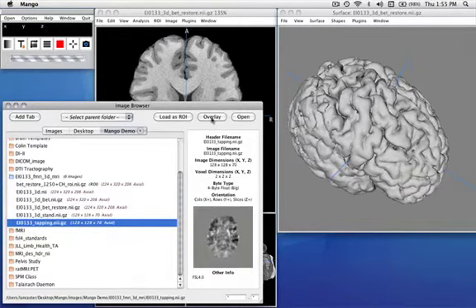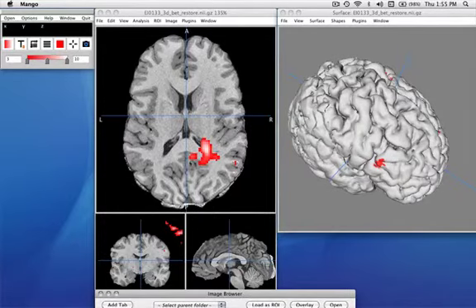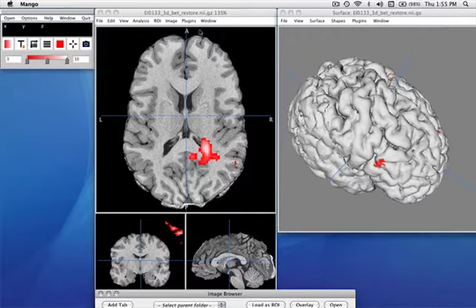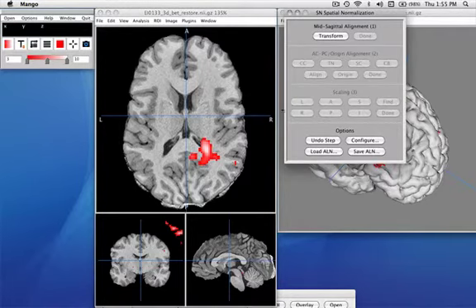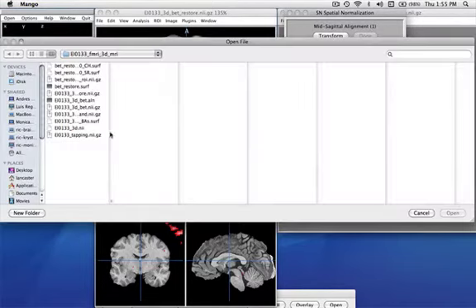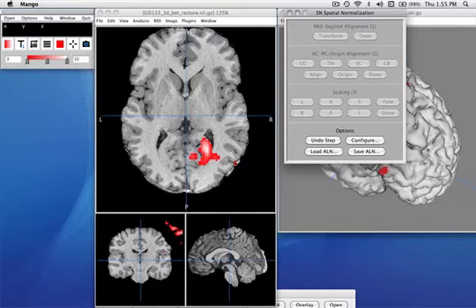I'm going to overlay this onto my image, and of course it didn't overlay right. There are a couple of things that have to be done to make overlays work well. We prefer to do overlays in Talairach standard space. I'll open up the tool we use to move things into Talairach standard space. We've already saved the alignment file to do that, so I'll click on it. You can see that the image got moved, and so did the 3D surface.